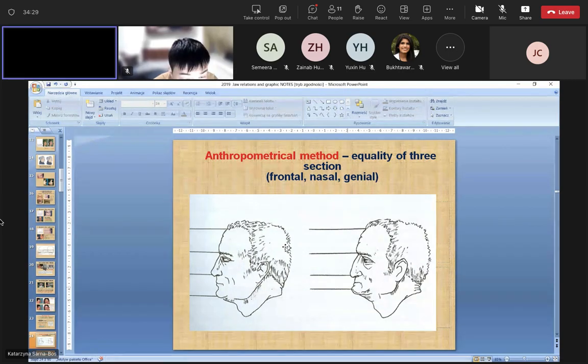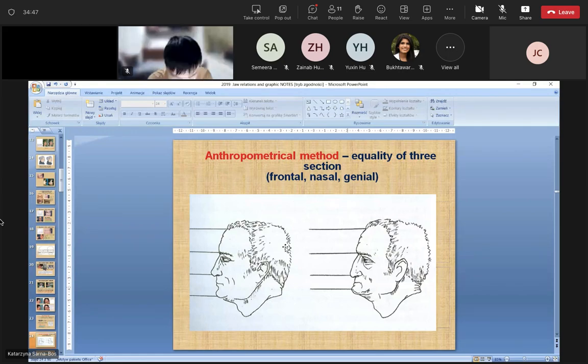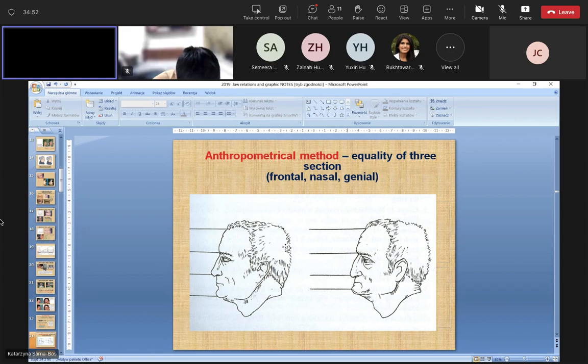And when we try to rebuild the occlusal vertical dimension, we need to make the proper height of the wax record blocks. So this is one of the methods which help us make the proper height of the rims of the upper and lower wax record blocks.